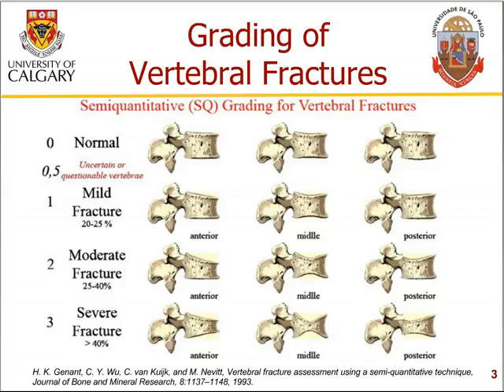Here is an example, an illustration from a paper by Gnan Wu. There are a few illustrations here. The upper row here shows the same normal vertebra copied for comparison.